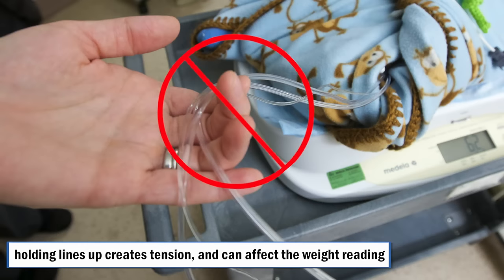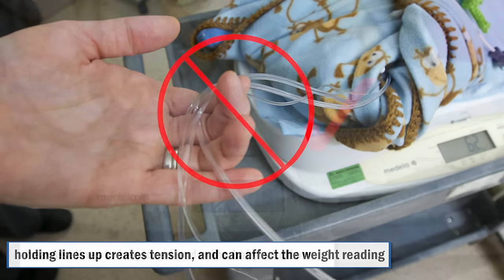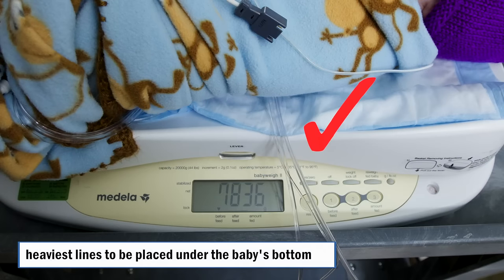Another accuracy issue is leads or IV lines being held up during the weight. There is no way to know exactly at what level you are holding the lines, so it can easily be different for the post-weight, impacting accuracy. Remember: if possible, leads should be disconnected for the moment of weighing, and the heaviest part of the lines that cannot be disconnected should be placed under the baby's bottom, with the rest of the lines loosely hanging over the side at the same location for both pre- and post-weights.